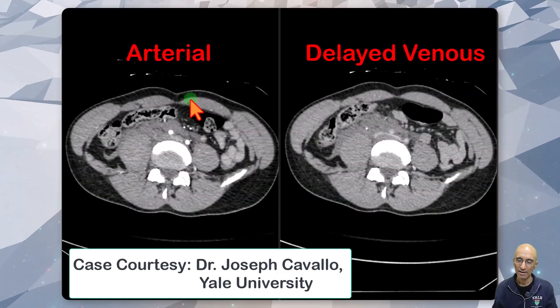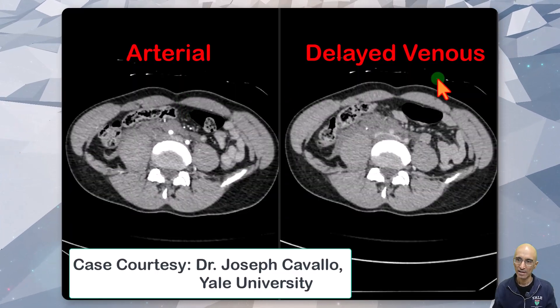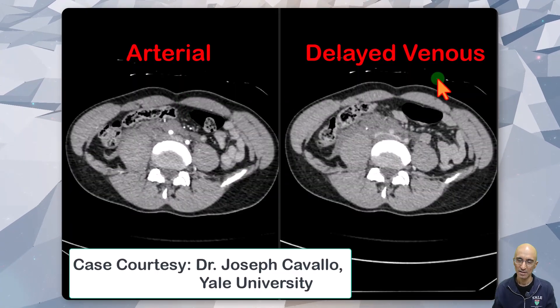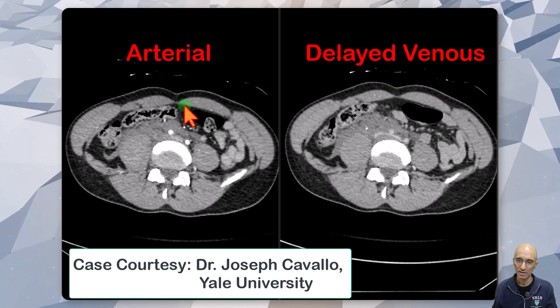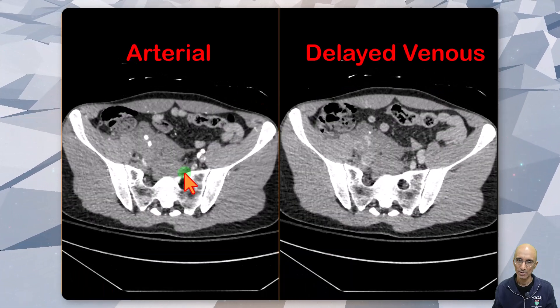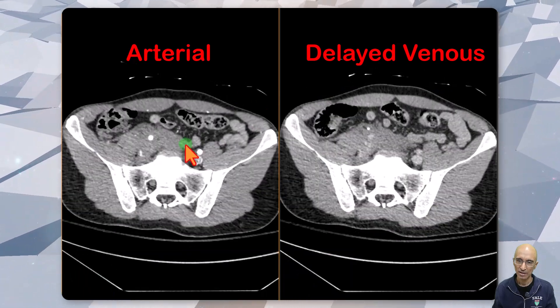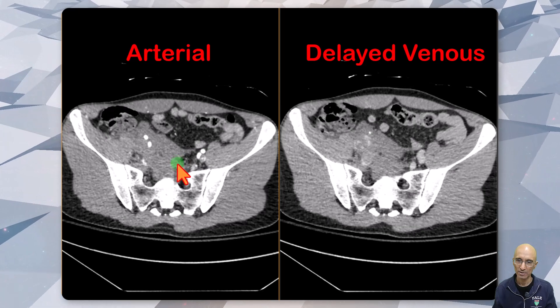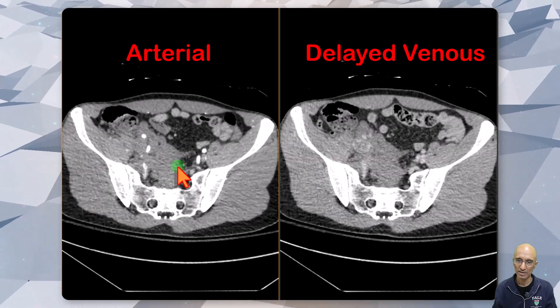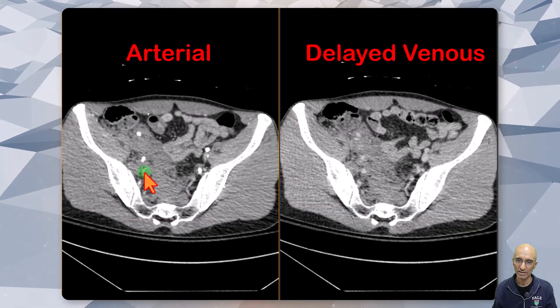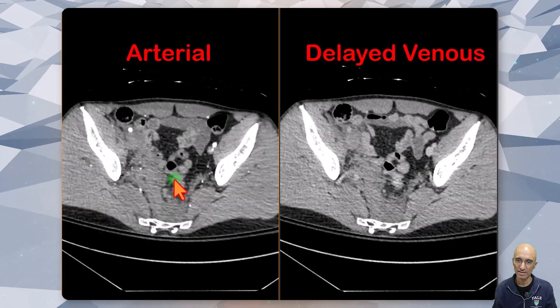I have arterial and delayed venous phase images. On the arterial phase images, as I scroll through, we can see a large retroperitoneal hematoma which is surrounding the iliac vessels on the right side.